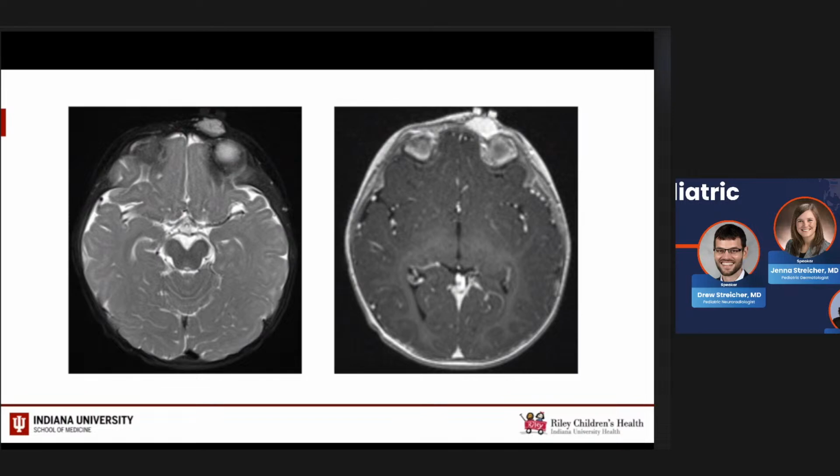And you can do a dynamic post-contrast sequence with venous malformations to help increase your confidence as well, and you'll see progressive enhancement over time. I know we've done that on the adult side in the head and neck group. We've started doing some dynamic post-contrast images for the venous malformations. It can be very nice. So that's something to consider protocol-wise if you have a lesion that you aren't sure about, to further characterize it and increase your confidence.